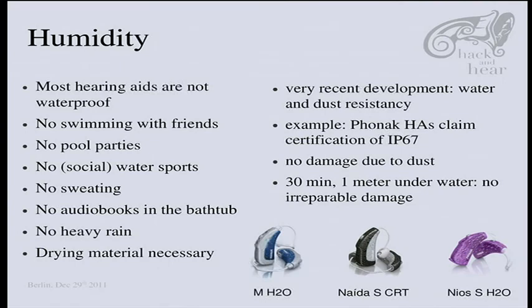So if you go to an open air concert and it starts raining, you really have to take care of that. Also, just like wet hair, when you get out of the shower, you have to wait until your hair is dry until you can put your hearing aids in again.